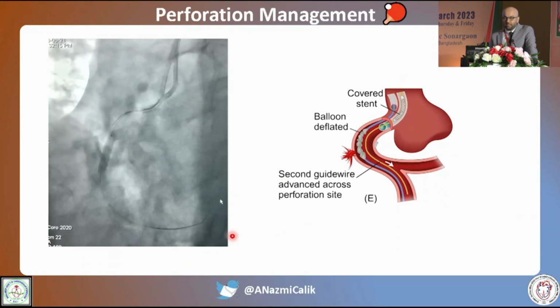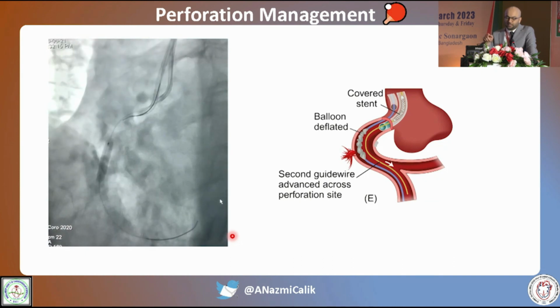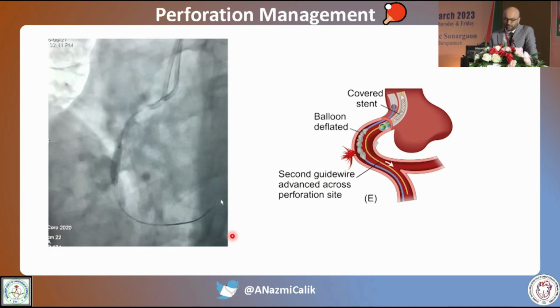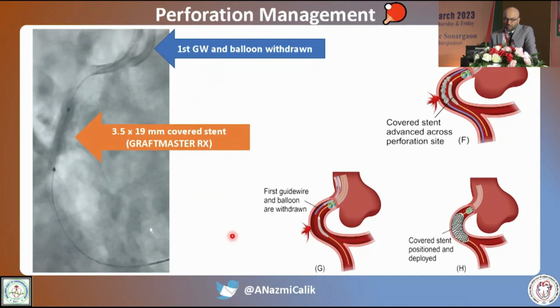After deflating quickly, you can advance the guide wire distal to the perforation site, and then you have to inflate quickly to prevent bleeding.